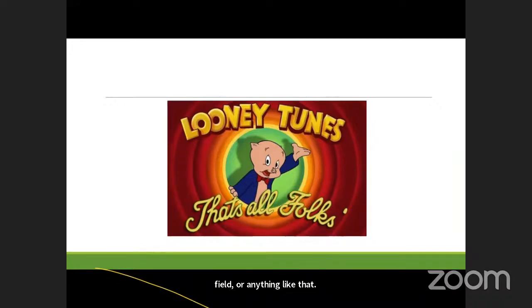Any other questions? Some of the newer generation LMAs, Doctor, that I was mentioning, which we are using, have a port where you can put a tube into the stomach and then aspirate. So those LMAs, I think you can use for a prolonged time. There are third generation LMAs which have come into the market, and many are using them. The interesting thing is, through the same port, if you are not comfortable with your ventilation of the patient, you can also intubate through that. So I feel that with these newer generation LMAs, you can maintain the patient for a very long time, even on ventilators.